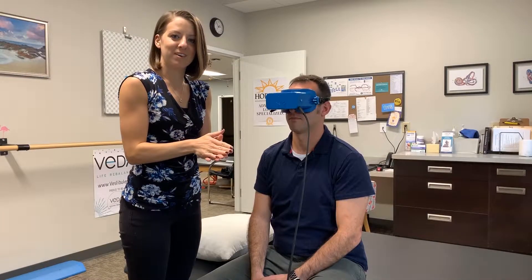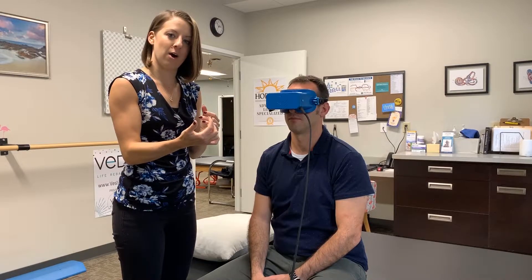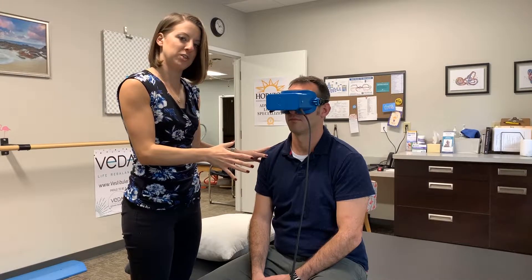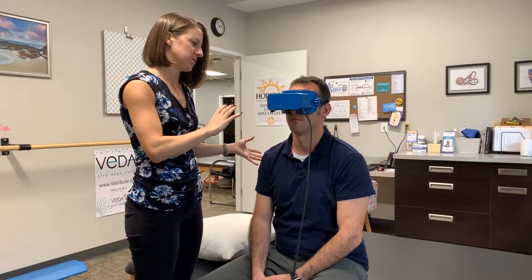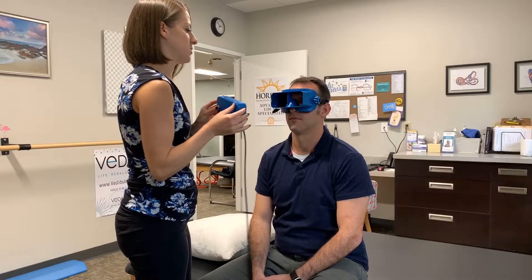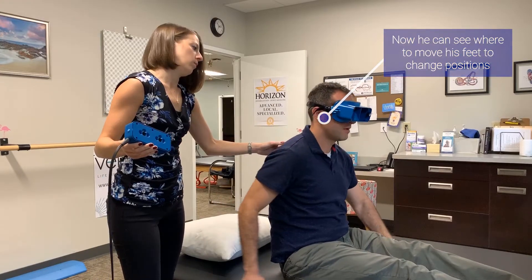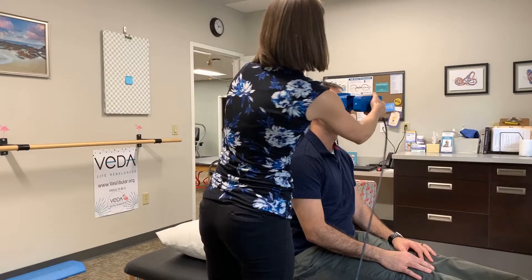Another feature I really like is that you can take the front of the goggles off. With the first version, I had a little difficulty moving the patient from bedside evaluation onto the table for positional testing. Now there are two little release buttons — you just push those. I can have the patient bring his legs up onto the table while sitting and facing the back wall, and once I get him ready for repositioning maneuvers, I can just pop the front back on and we're ready to go.